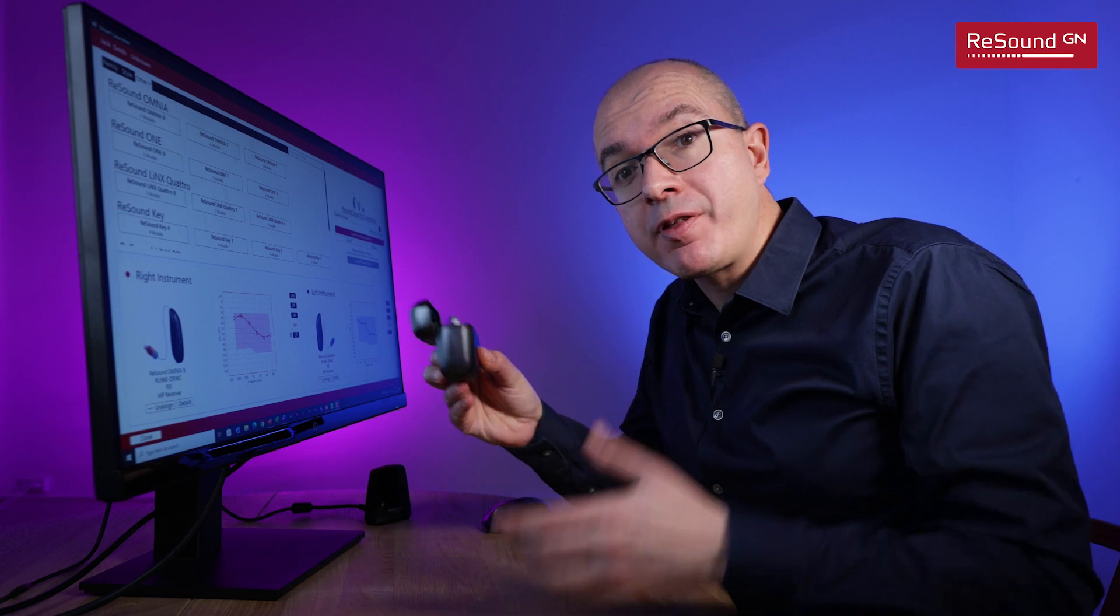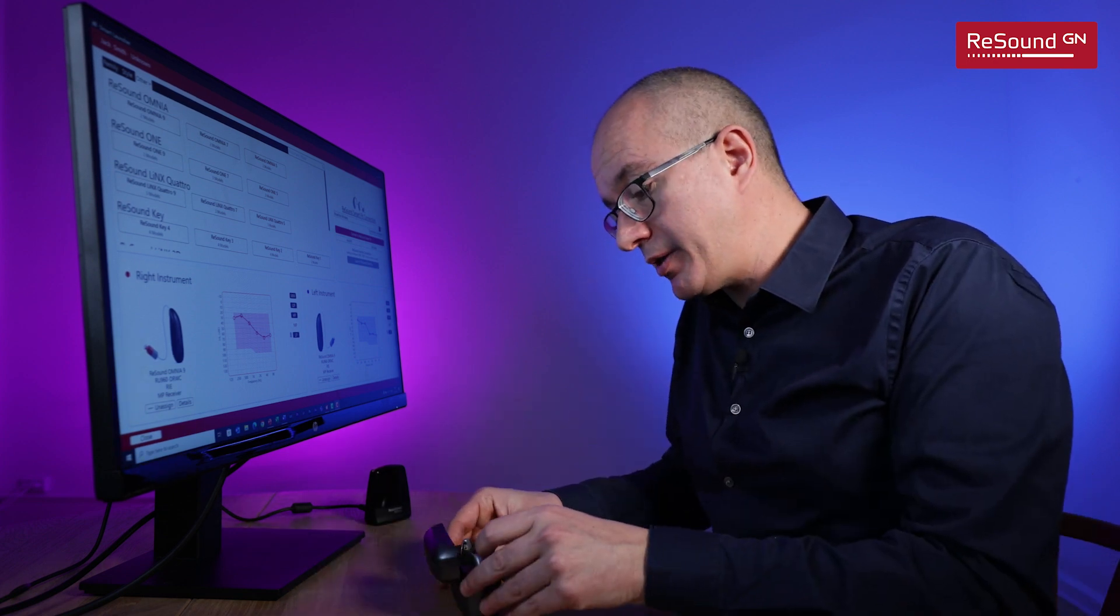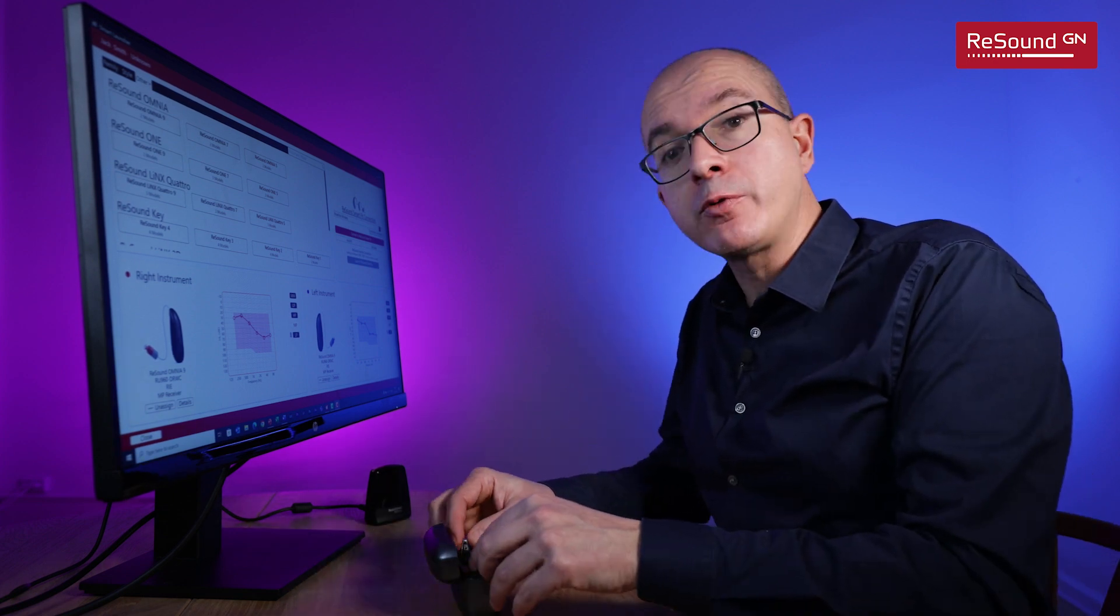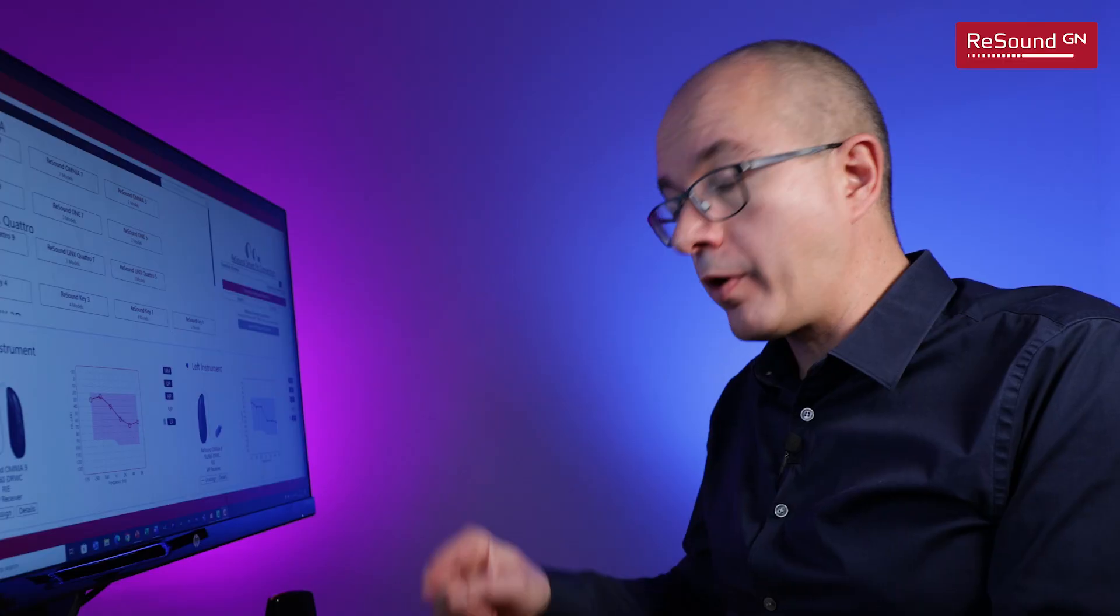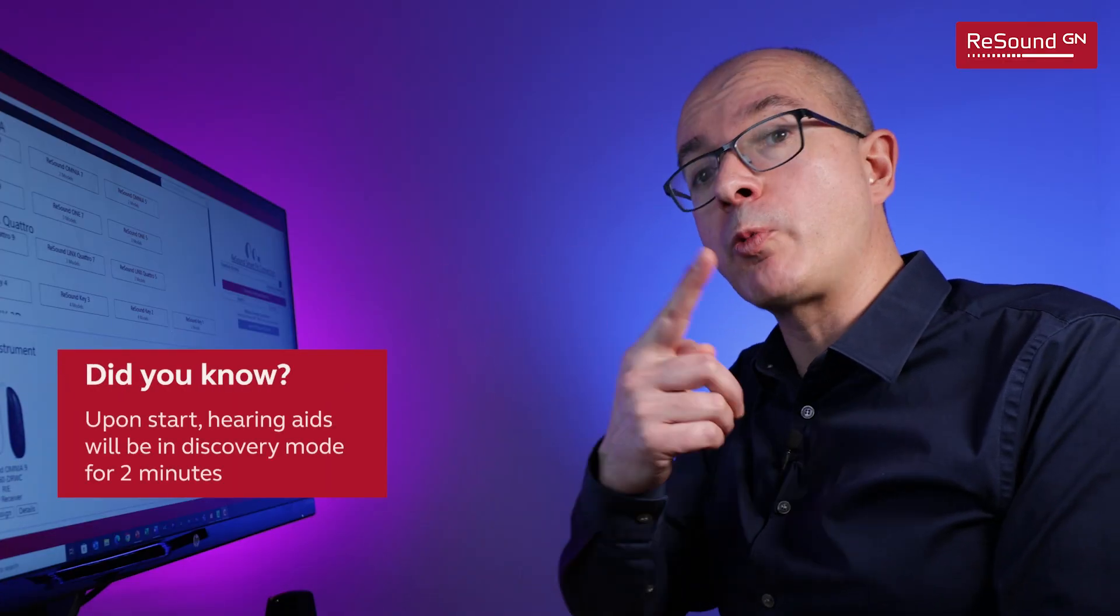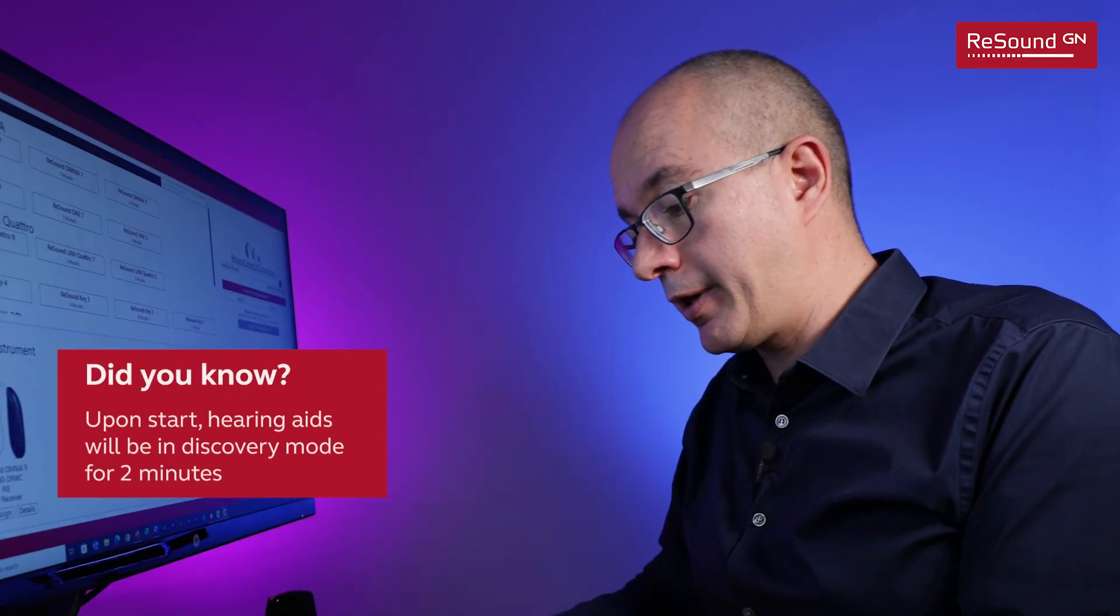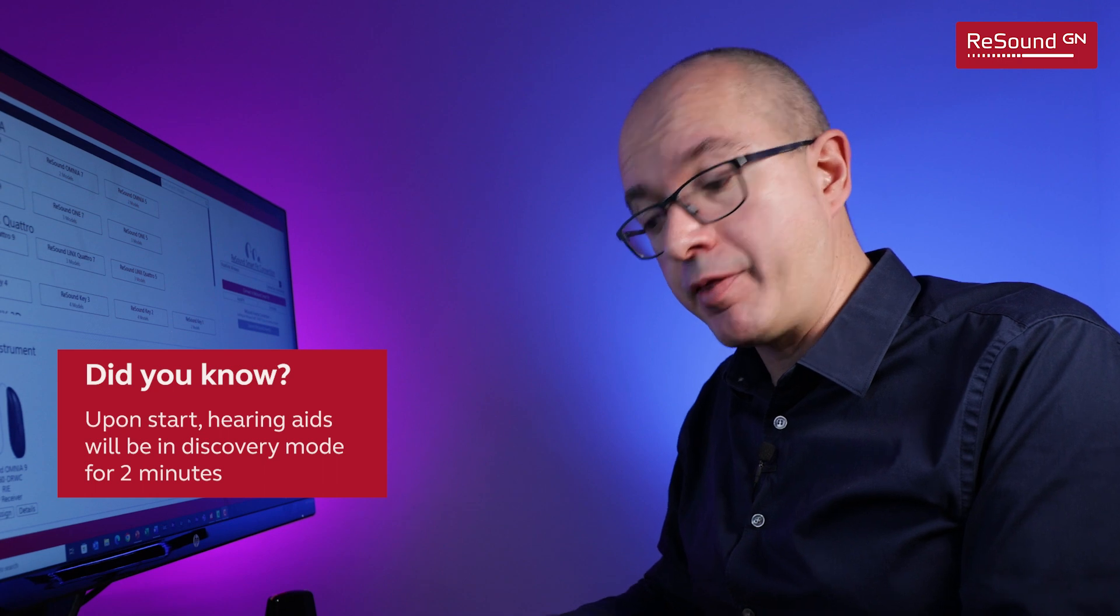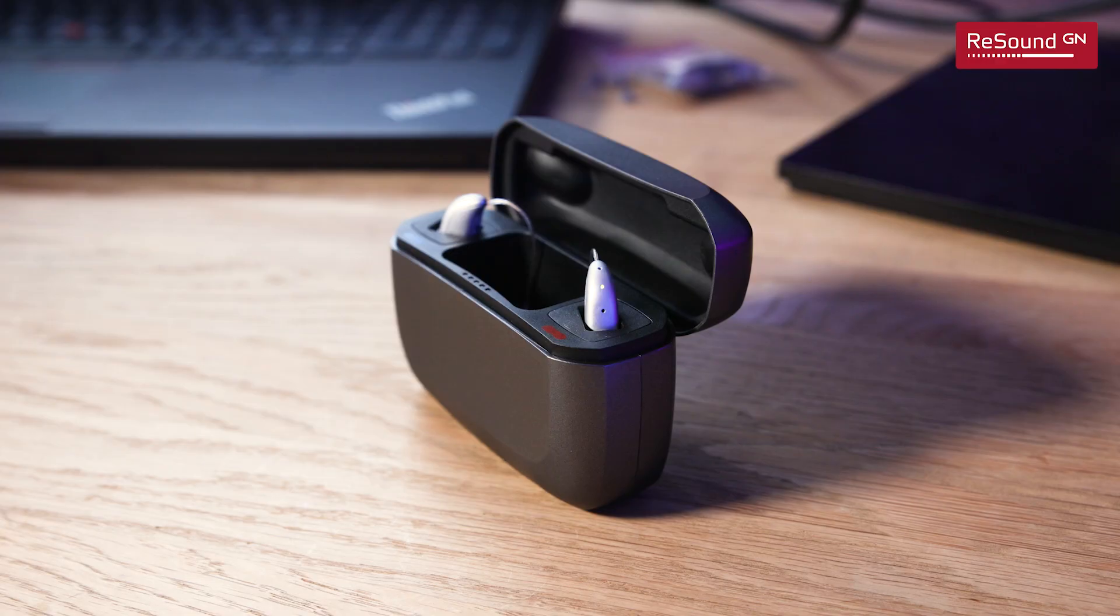So to connect the hearing aids to the fitting software this is the button that we have to use and that's what we're going to do now. How do you connect something that has no cables? Well it's very easy. What you have to do is to switch the hearing aids on.